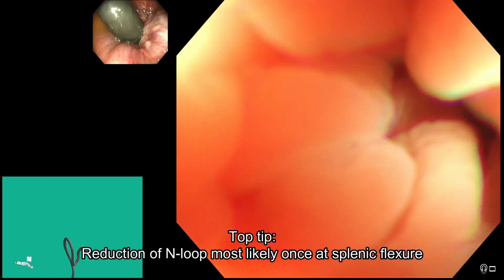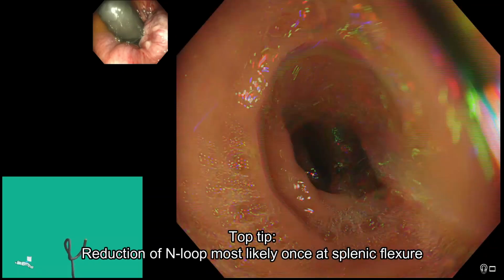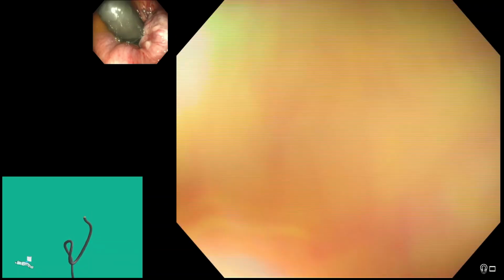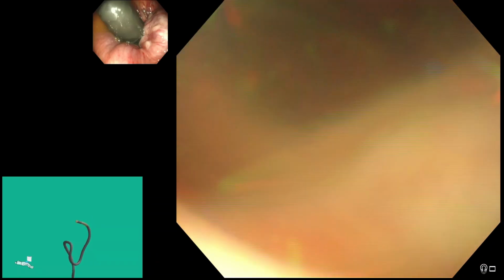So with this lady, we're actually going into more of an N loop now. So we're going to get to the splenic any second now, and then we should be able to straighten. And usually at this point I'll turn onto the back just to make things a little bit easier, and I'm straightening the scope, so I always suck when I straighten.